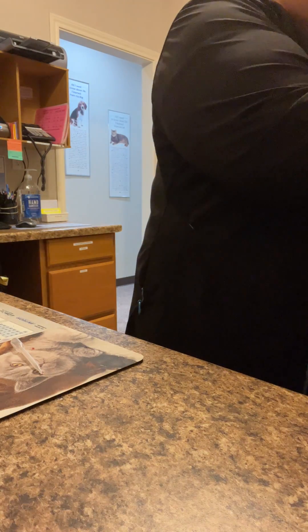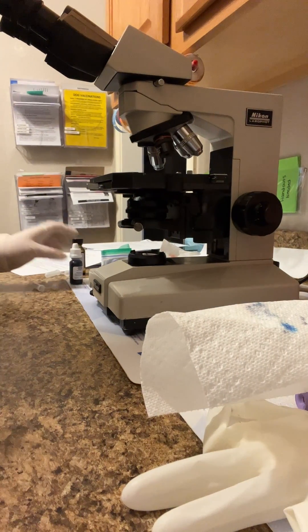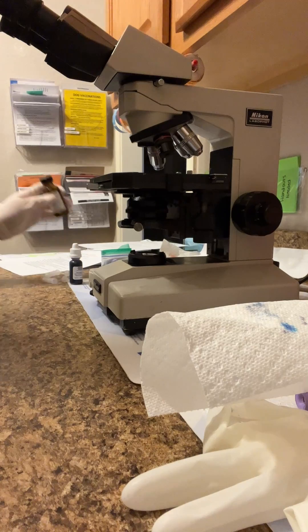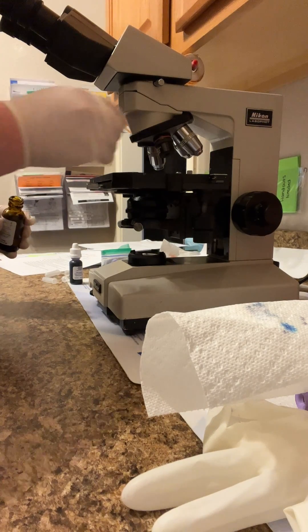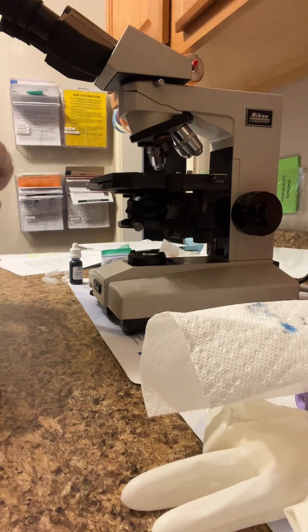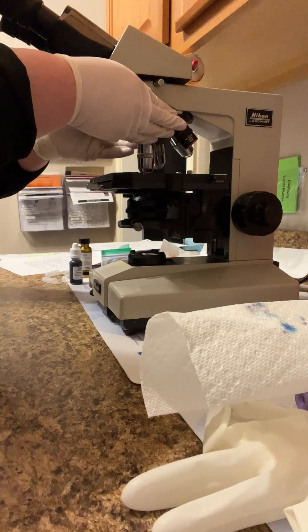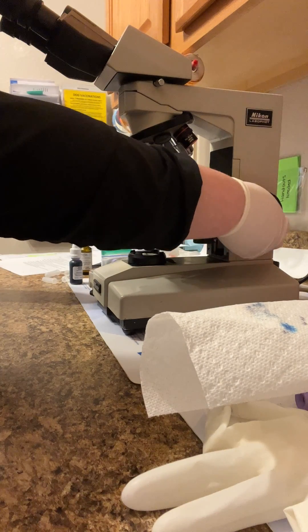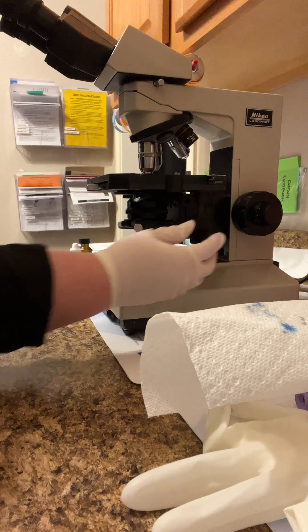And then observe microscopically under the microscope, placing a small amount of immersion oil on top of the coverslip, and observing for any micro-agglutination. And here we go.